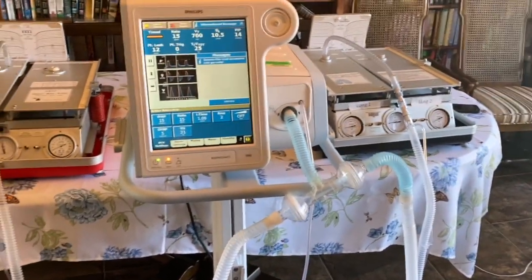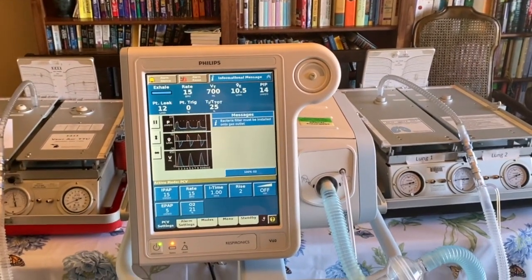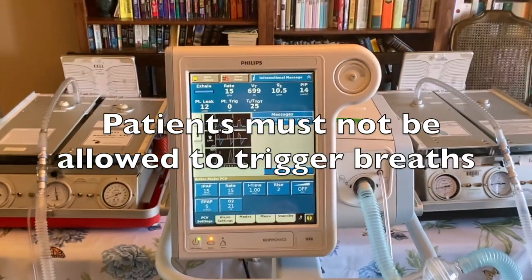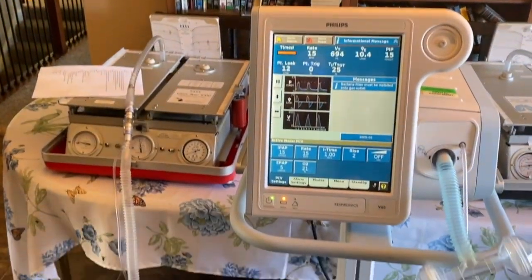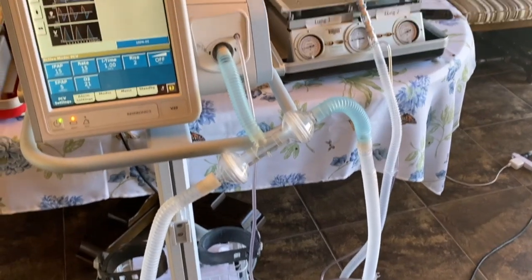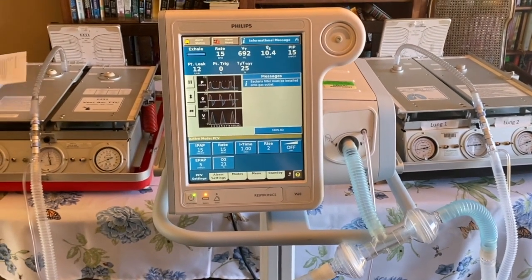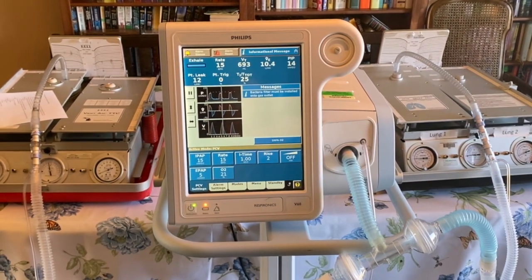Another key fact is that we cannot allow patients to trigger breaths with this. Probably what we will have to do is ventilate patients that are heavily sedated or sedated and paralyzed, not allowing them to trigger additional breaths. Because we're using pressure control ventilation, we cannot guarantee tidal volume. We can monitor the driving pressure and help regulate it to an extent, but we are not able to guarantee six mils per kilo or four mils per kilo. We'll have to use our clinical skills to evaluate each patient individually.